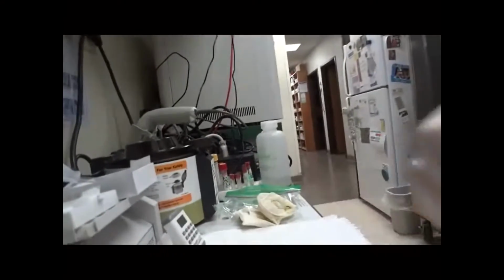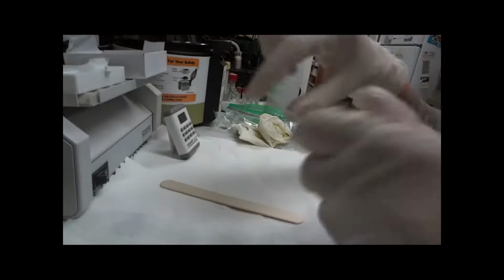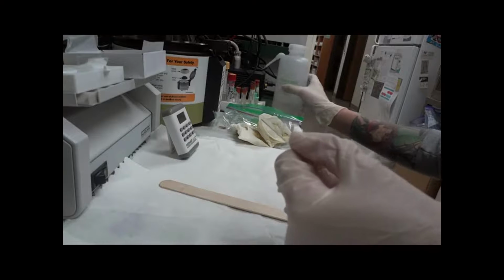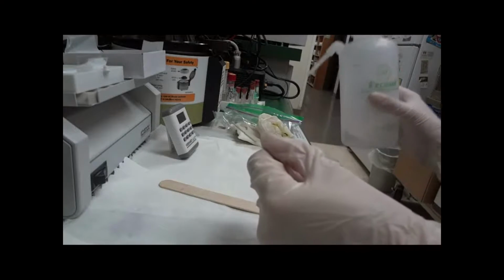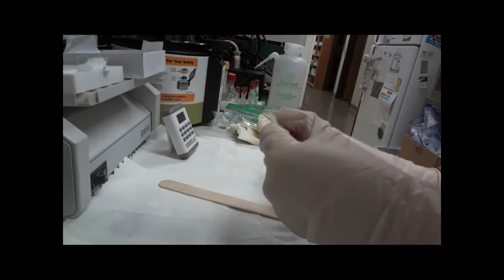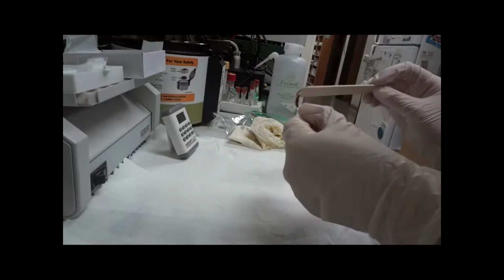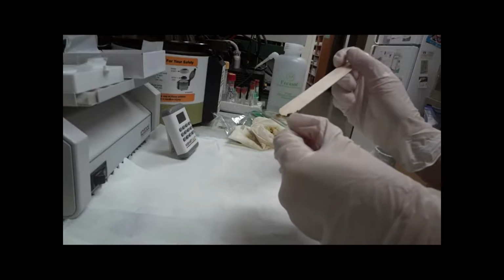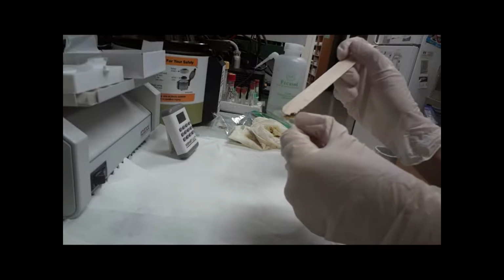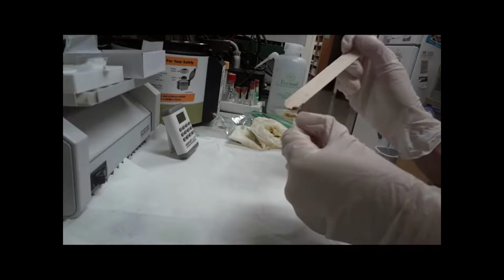Performing a direct fecal smear. Alright, we'll take our glass microscope slide and apply equal parts of the Fecasol with the feces onto the slide, making sure that it is clear enough for us to look under on the microscope. No thick lumps of feces that we won't be able to see through.